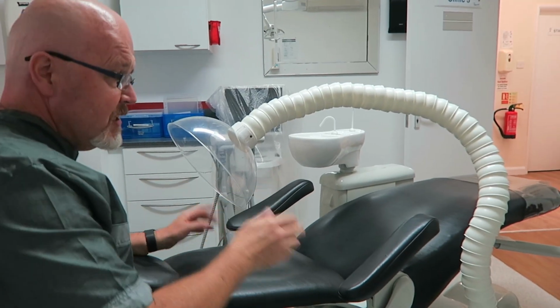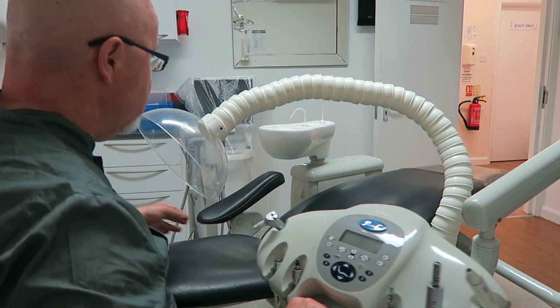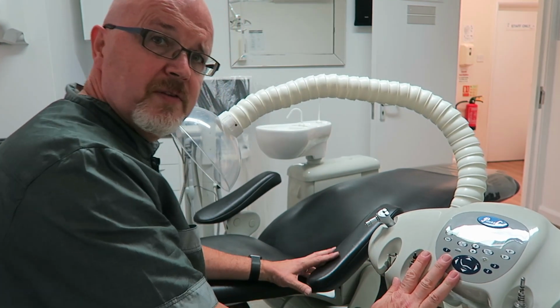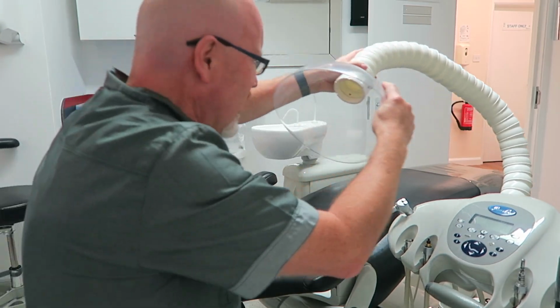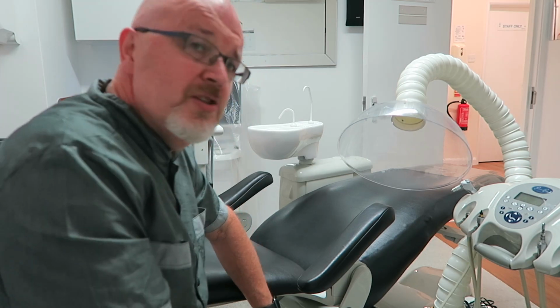So placement of the VacStation in this instance, haven't plugged it in of course, but here if you bring that far enough forwards with this sort of an arrangement like this, I suppose that doesn't get in the way. Okay, well that's the positioning of all the units in different surgery environments.